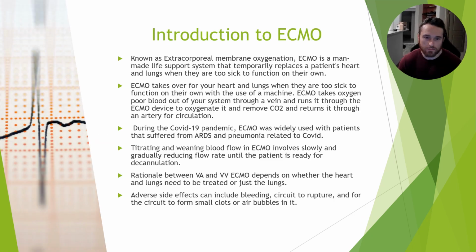So, introduction to ECMO. It's known as extracorporeal membrane oxygenation. ECMO is a man-made life support system that temporarily replaces a patient's heart and lungs when they are too sick to function on their own. It takes oxygen-poor blood out of your system through a vein, runs it through an ECMO device to oxygenate it, and removes CO2 on the way out, and then returns it through an artery for systemic circulation.